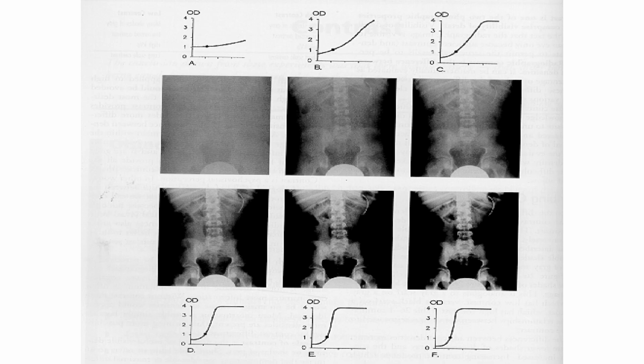So, pero kung ang procedure ay vertebrae, let's say lumbosacral, okay, the best image is letter D. Okay? Yun ang best image natin. Letter D. Okay?